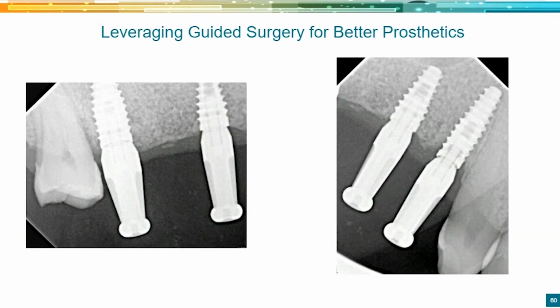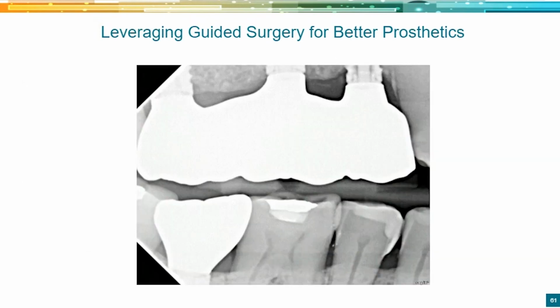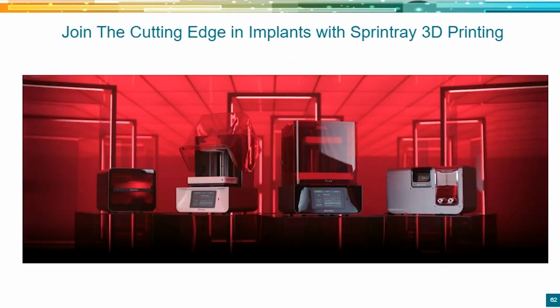Patient comes back, bone all healed beautifully. We take an impression, and we see our final four-unit splinted bridge.